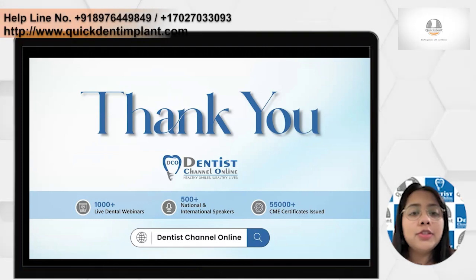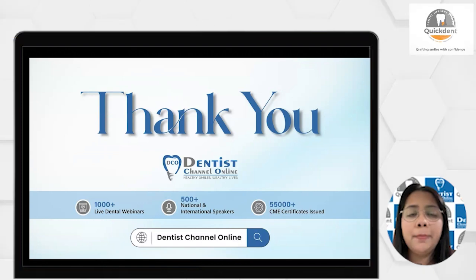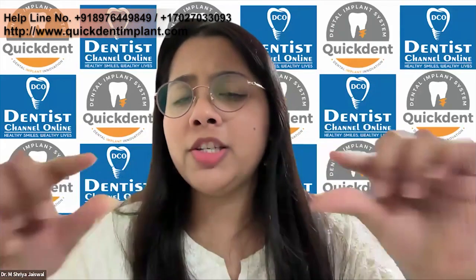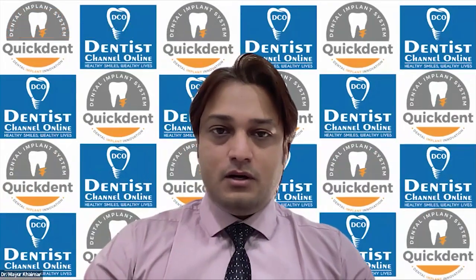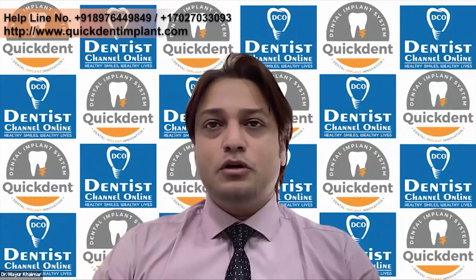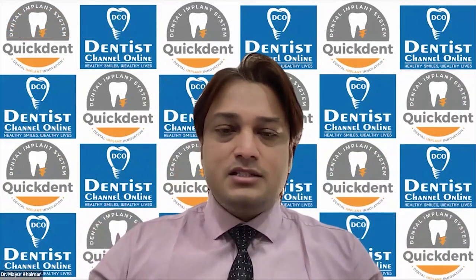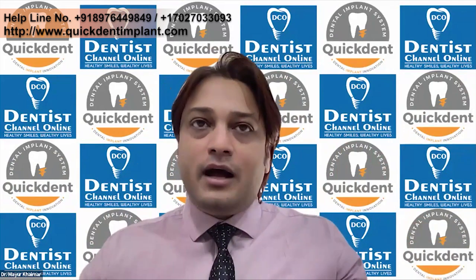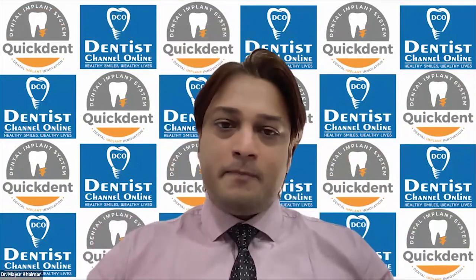The first question is from Dr. Kostavkar. In between the trial and the implant, there is some orange material. What is that? That's a bite registration paste. It all depends on your interarch distance. If the interarch distance is minimal, you use bite registration paste. If the interarch distance is too much, you use wax. A wax could be an alu wax or a red wax, as an interocclusal record. Yes, it's an interocclusal record.